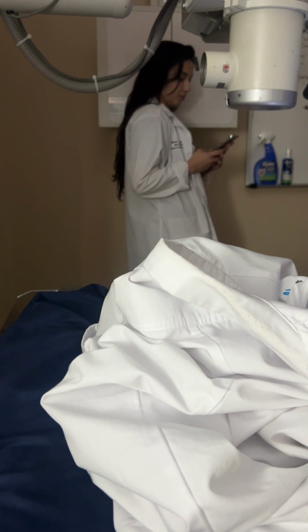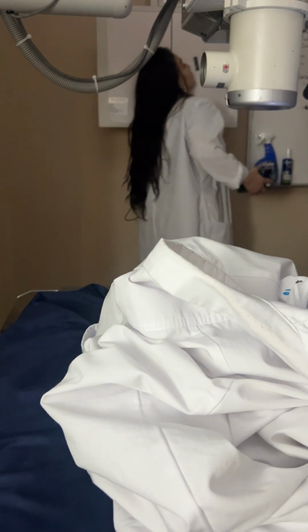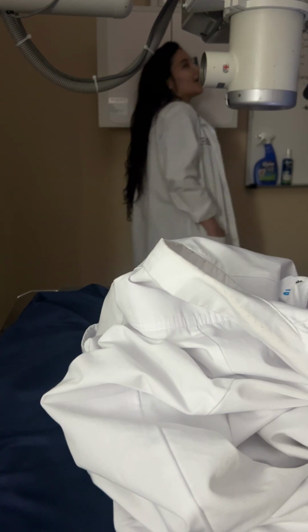Okay, so how you rotate the patient for the mandible will determine what you see. For a general survey, most people nowadays just do a Panorex.